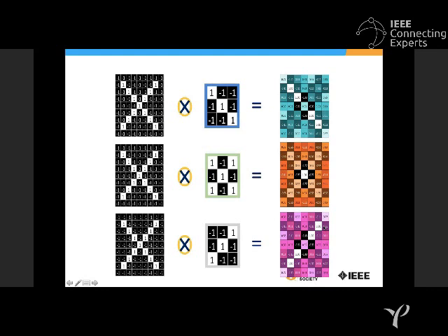So I can easily understand the spatial location of my feature corresponding to each of these filters. If I call this filter A, this filter B, this filter C, then filter A gets a maximum outcome at this point, filter B gives a maximum outcome at this point, and filter C gets a maximum output at this and this point. It means these regions of the image are perfectly matched with the features which these filters define.